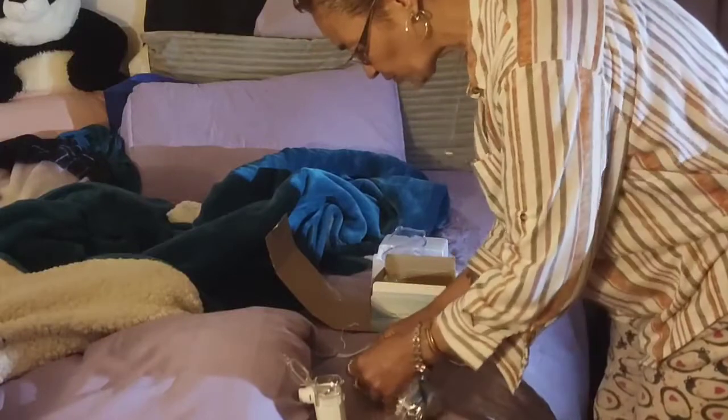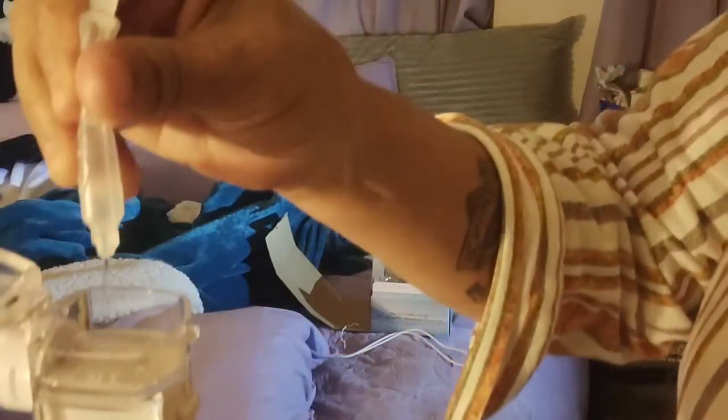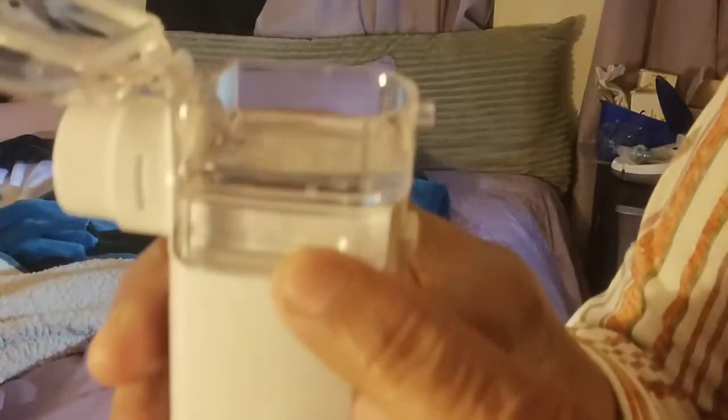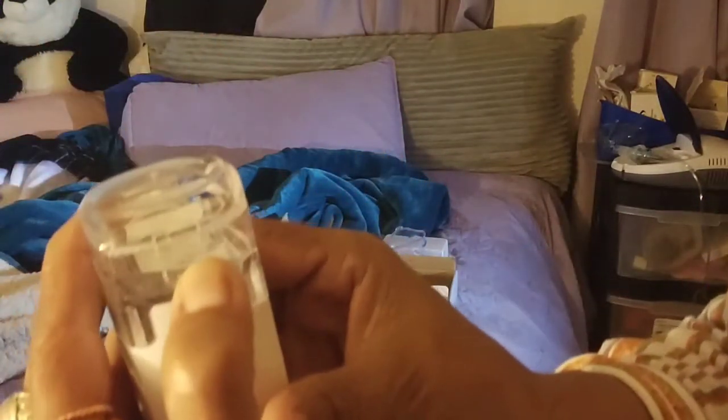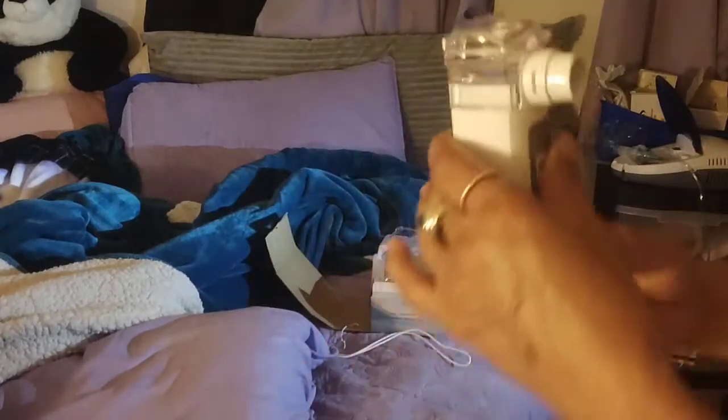So this is the regular albuterol nebulizer liquid. So we're gonna add 2. Here we go, guys. So we have 2. Now you see that it went up to the line, okay? You lock it. It's locked. It's not going anywhere. It's not dripping, okay? That's a good sign. No drips, nothing like that. It stays right there. It does not flow through the mouthpiece. So that's a good sign.